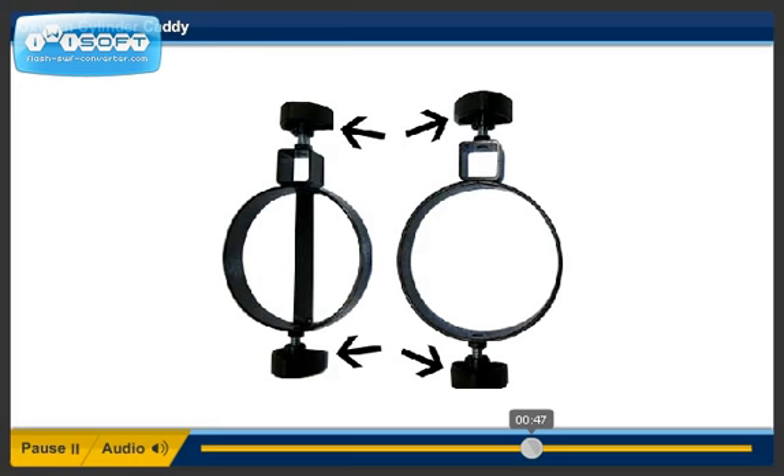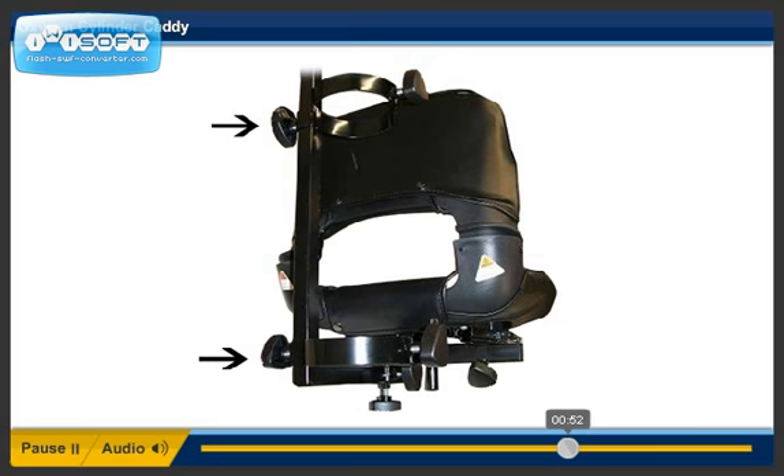Step 7. Install the lower cylinder holder on the L-bracket. Slide the base all the way down. Tighten the bracket.